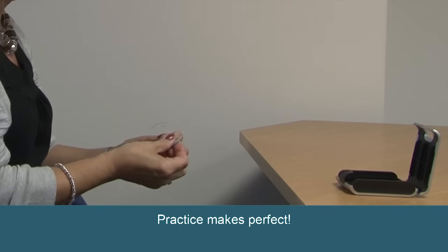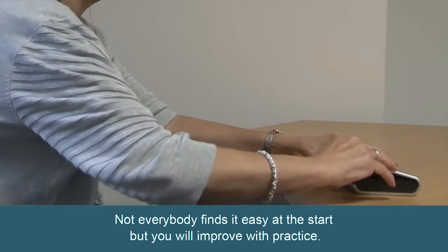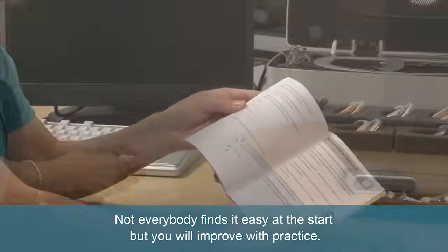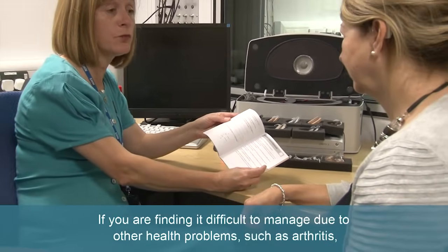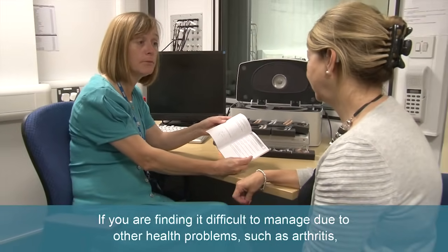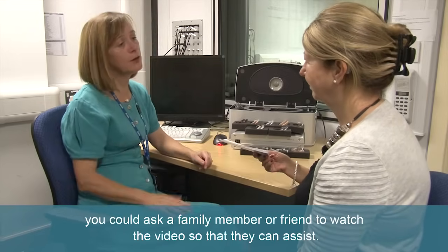Practice makes perfect. Don't give up — not everybody finds it easy at the start, but you will improve with practice. If you're finding it difficult to manage due to other health problems such as arthritis, you could ask a family member or friend to watch the video so that they can assist.